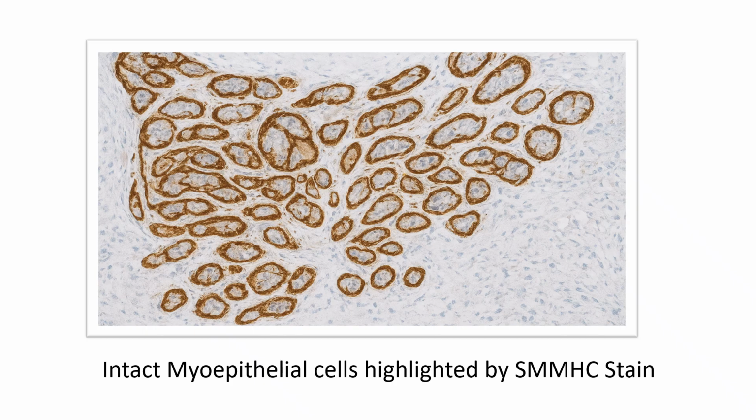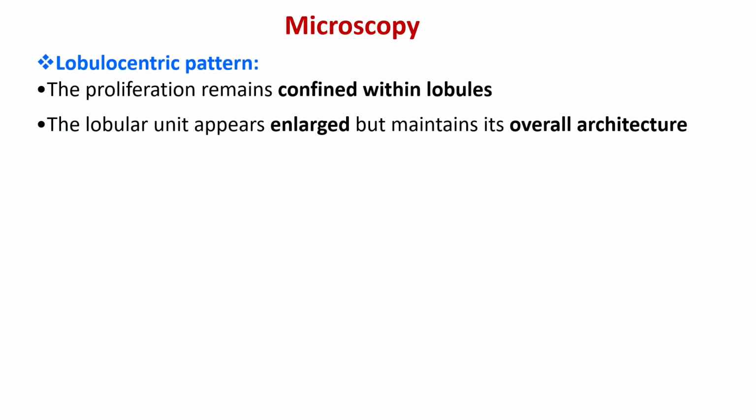Coming to the microscopy of adenosis, there is lobulocentric pattern, which is the classical feature of any adenosis.